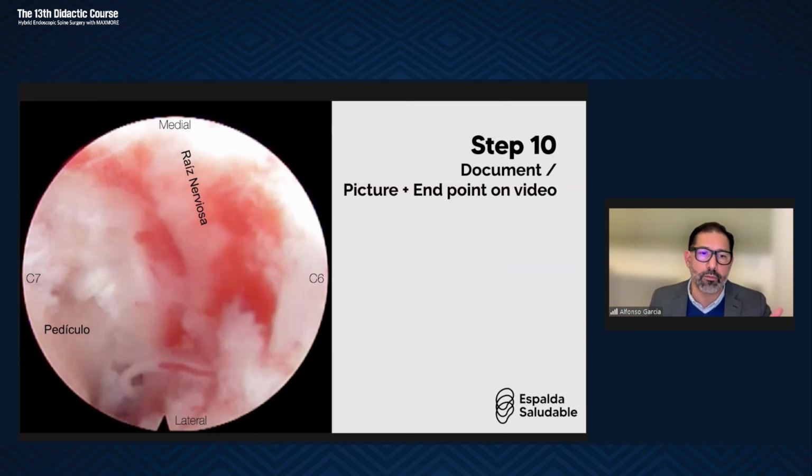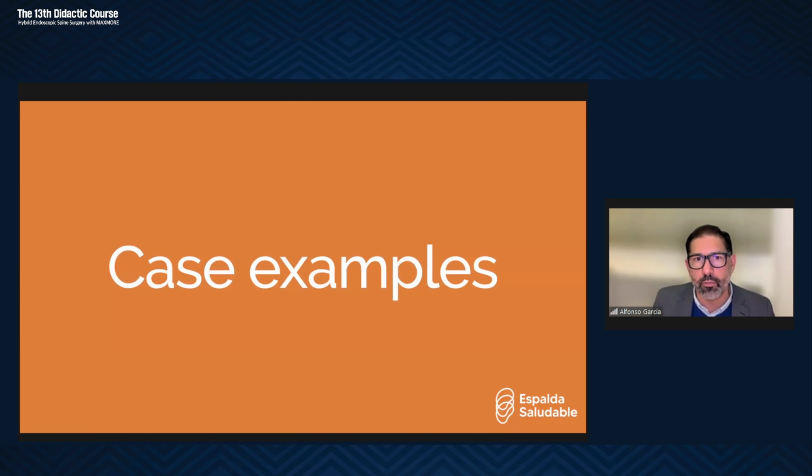And for the end point, take pictures and record every step of the decompression.